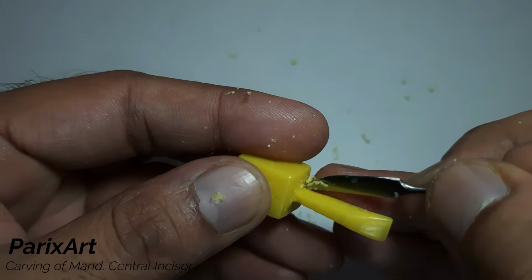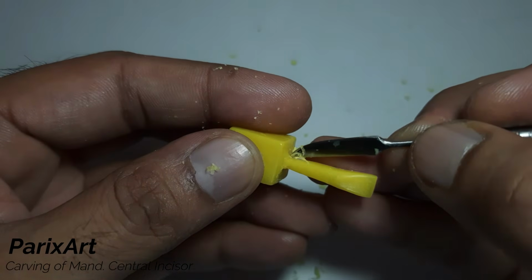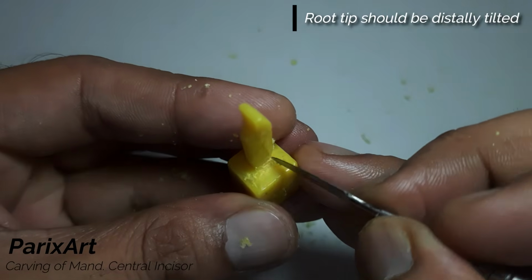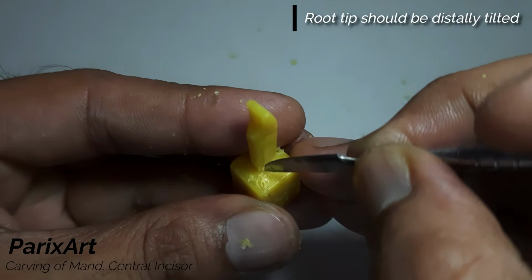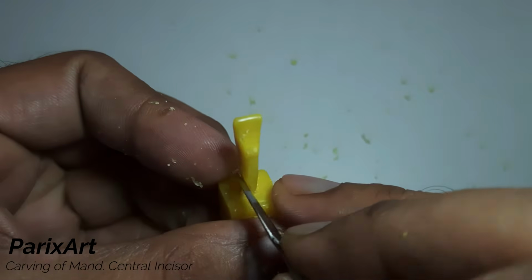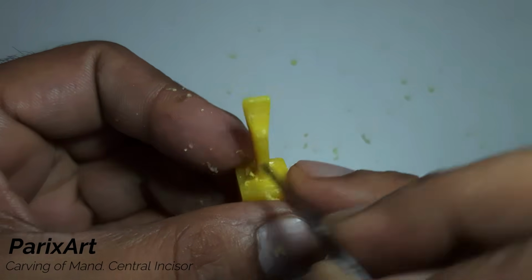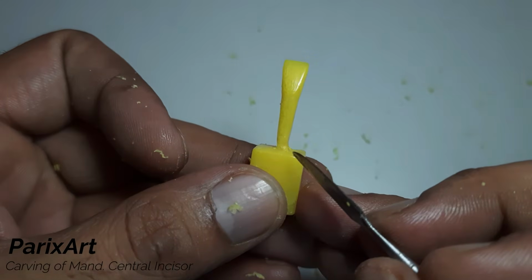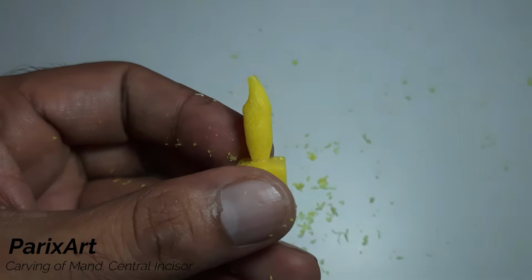Now developing the slight tilt to the distal. Now see the tilt. Now we'll work on the proximal aspect.